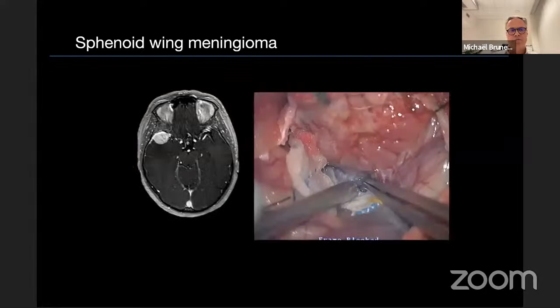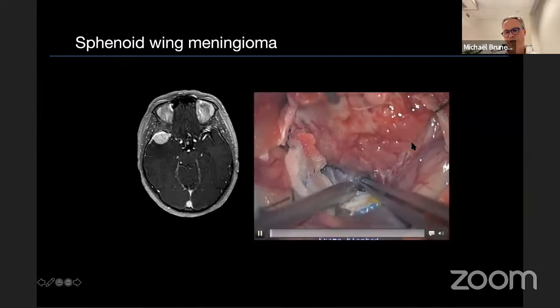What can happen when we are treating sphenoid meningiomas? It looks very easy, small tumor, but have a look at what can happen. There is some combination, and when we are treating a skull-based tumor, we have to be able to manage also the vessel.